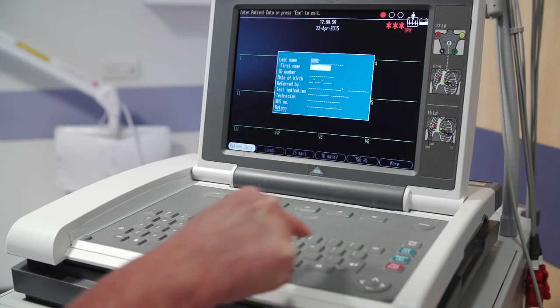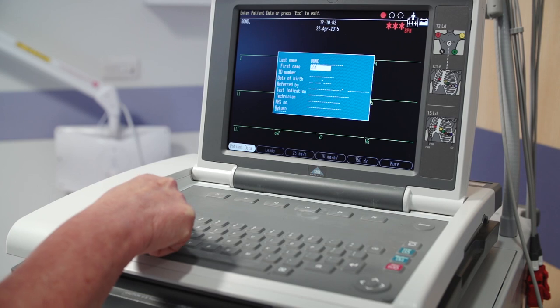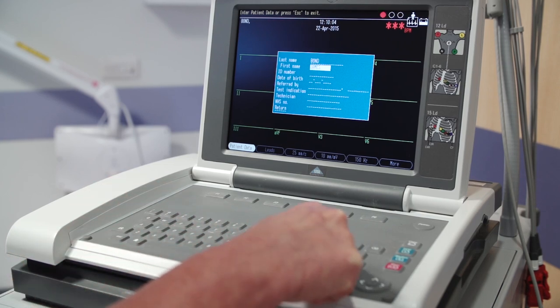You must also check the patient's details with the patient, which includes the name, the hospital number, and the date of birth.